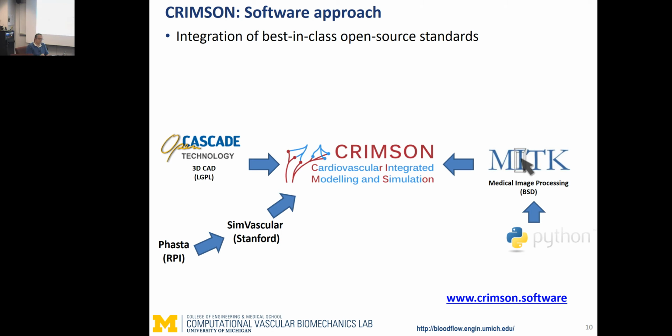Once we have a segmentation, we do an analytical interpolation. And there are a number of advantages there. It makes surgical planning very easy because you can do parametric alterations of your geometry very easily. Boolean operations are simpler, of course, if you have a CAD model rather than doing them with a mesh. So we have these things already incorporated.